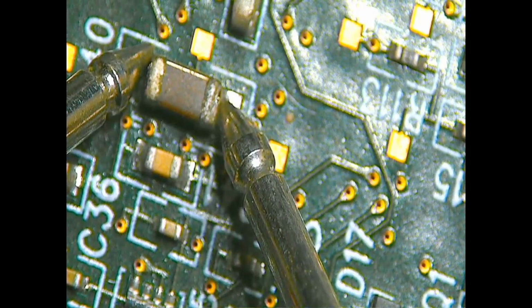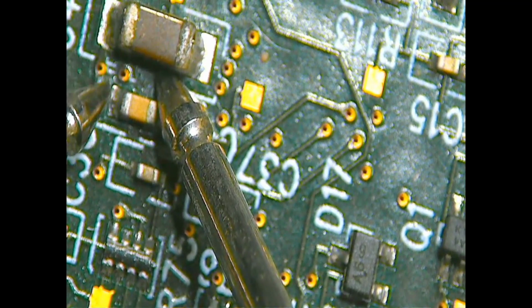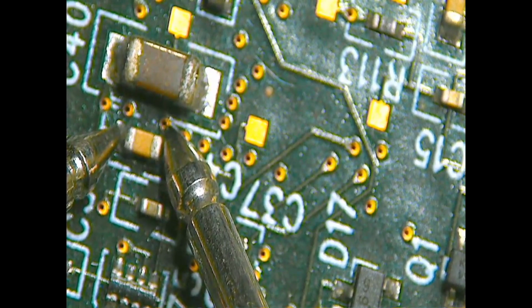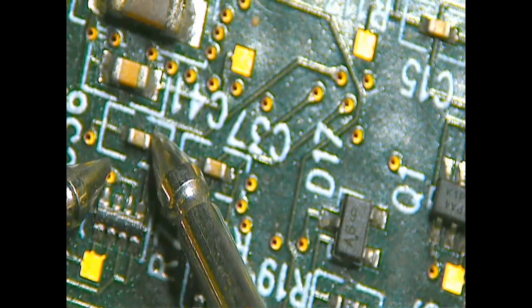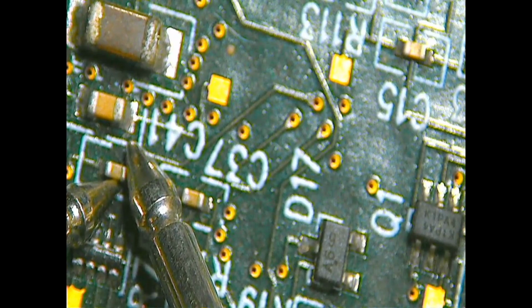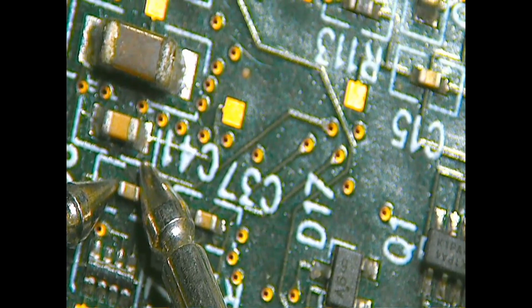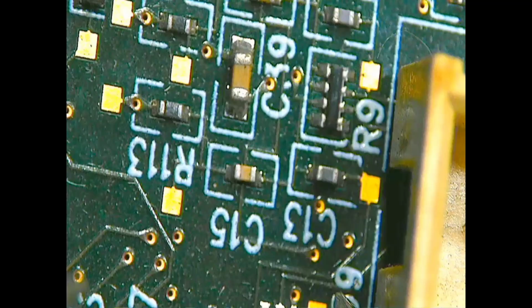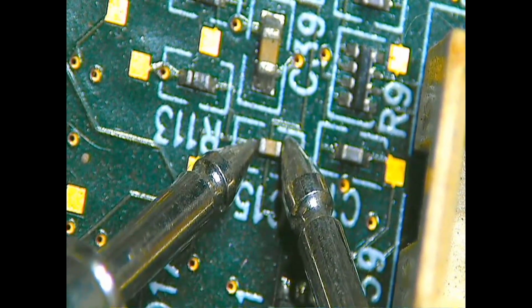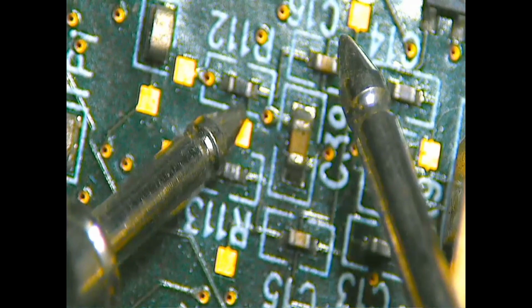Showing 17.2 ohms, which is not good. And this one also 17.2, which is also not good. So the board might be... this capacitor looks good. It's showing 696, which is good. And this one, showing 1.792, which is good.